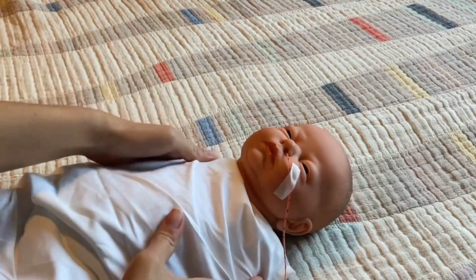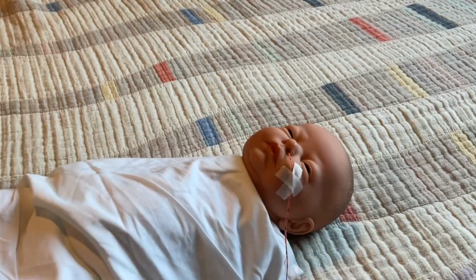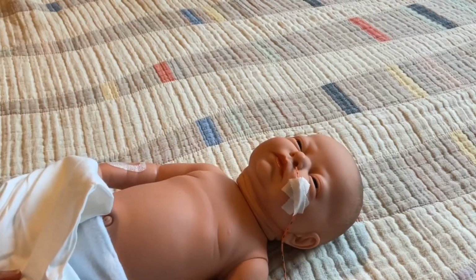Once you verify you're in the correct spot, you can tape down the NG tube better to the baby's face to make it more secure. And that is it.